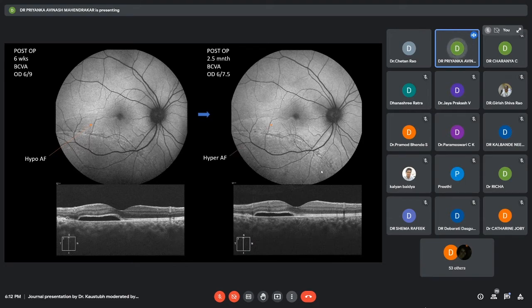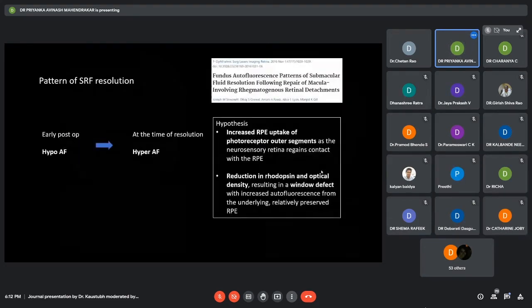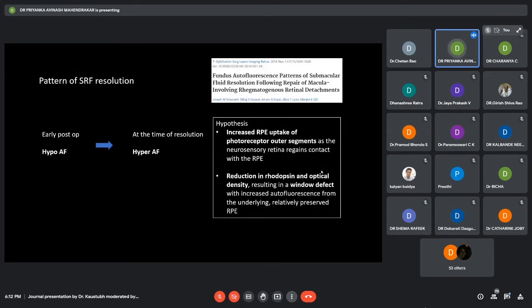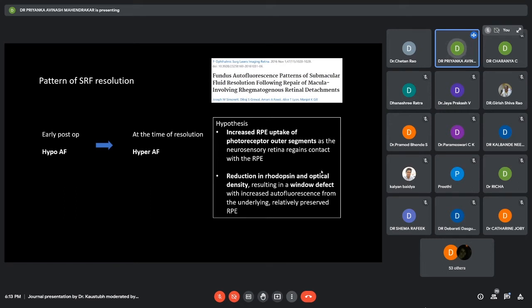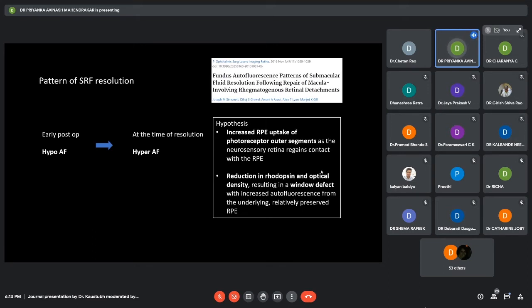Now, this phenomenon can be actually explained by the hypothesis that initially, in early postop phases, we see hypo-autofluorescence in the SRF. And at the time of resolution, there is hyper-autofluorescence. There are two hypotheses to this. There is basically increased RPE metabolism because of photoreceptor interaction as the SRF is resolving, as there is resolution of the SRF because the neurosensory retina regains contact with RPE. The second hypothesis is that there is reduction in the rhodopsin and optical density resulting in a window defect, with increased autofluorescence from the underlying relatively preserved RPE.